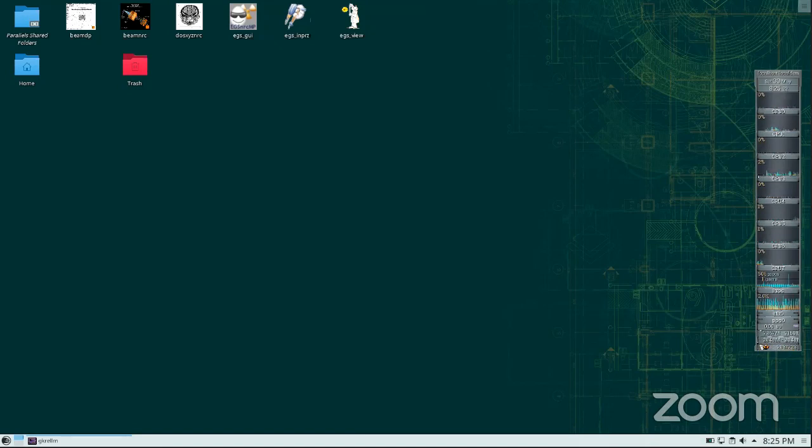We have the profiles. So we do simulations, calculate the PDDs and profiles, and compare to the measurements. If they're off, then we modify something a little bit in the simulation. We tweak that until we get them matched. Don't think Monte Carlo is accurate. Your measurement is what you rely on.